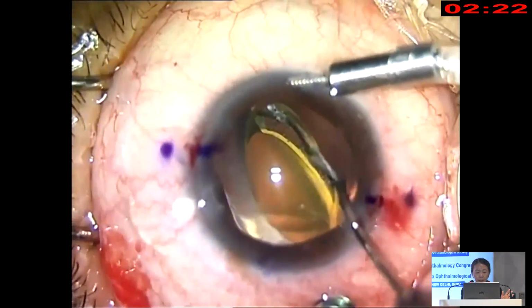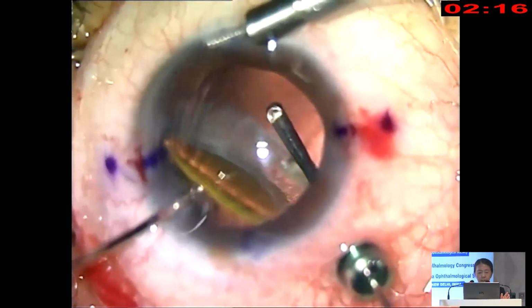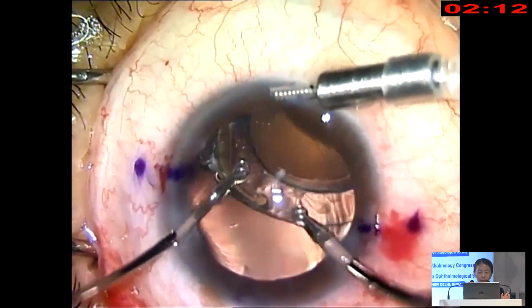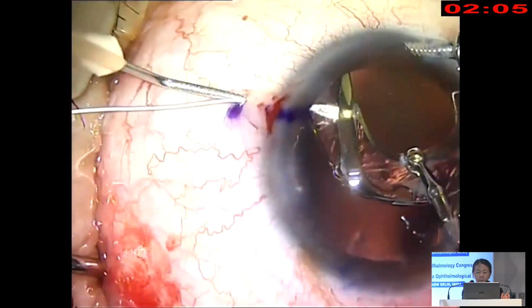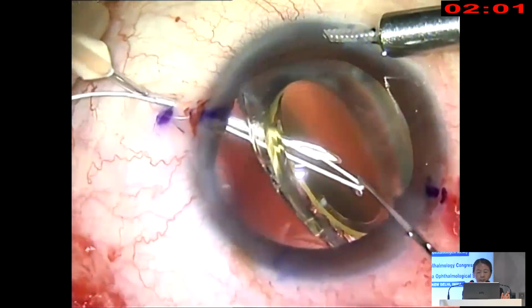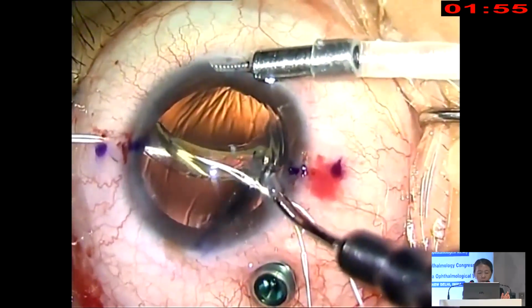This patient earlier had a CTR, but obviously that's not enough. Clear all the vitreous, as mentioned, that's the first step you really want to do. So you then get the lens into position. As I mentioned, this is the toric lens, and that's the axis. You can see the marks there. Come through posterior to the complex, go through the capsular bag at that junction there where the marks for toric axis are.